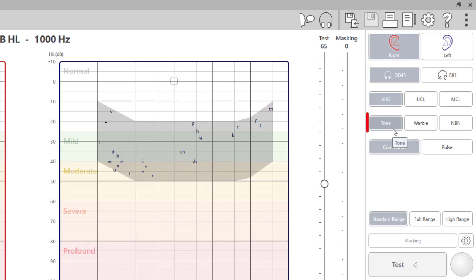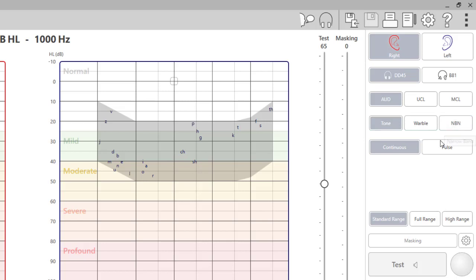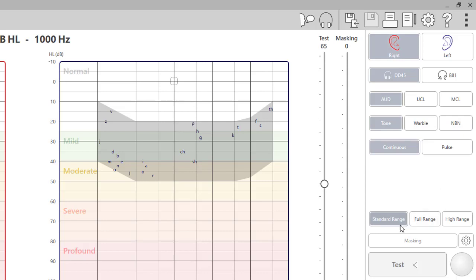Signal types include tone, warble, and narrow band noise. Pulse types are continuous or pulsed tone. The A2D, arc, and stealth will display the standard range from 125 to 8K.